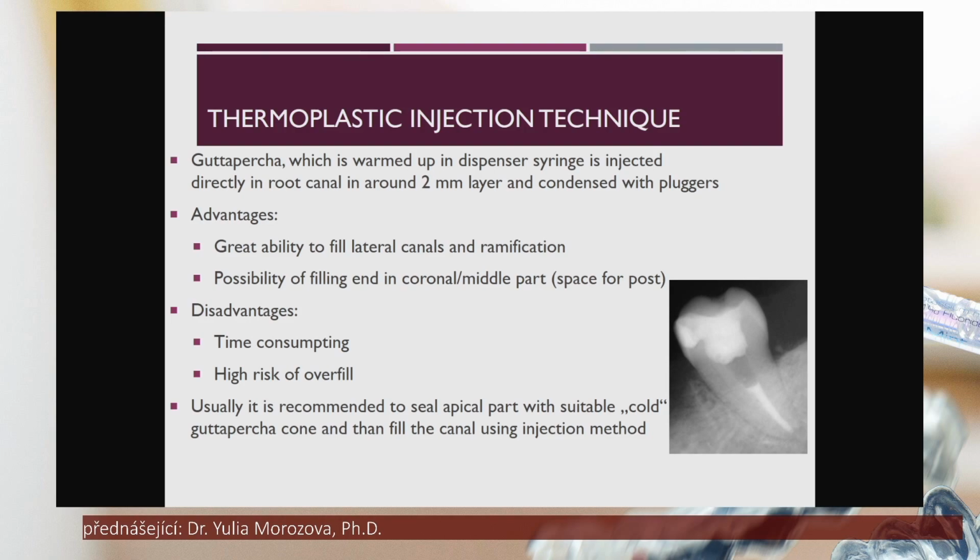With respect to advantages, in this case there is a great ability to fill the lateral root canals and ramifications. Also, it's possible to end our filling at the required length. For example, if we know that we need space for the post and core, we can finish our filling in the middle third of the root canal, and so we save time with respect to removal of some part of the gutta percha.